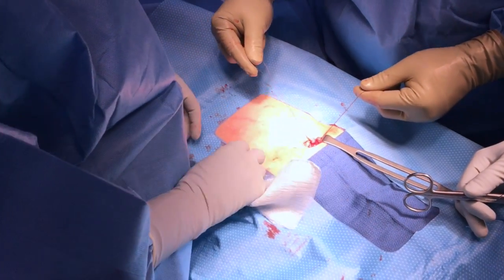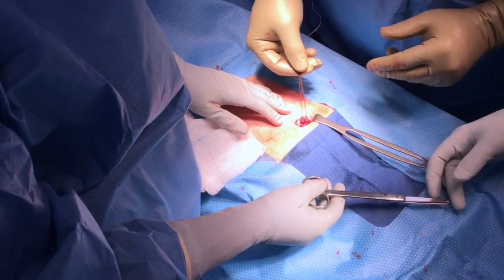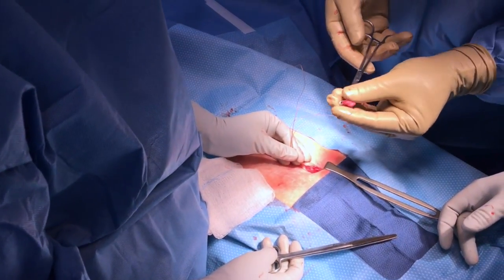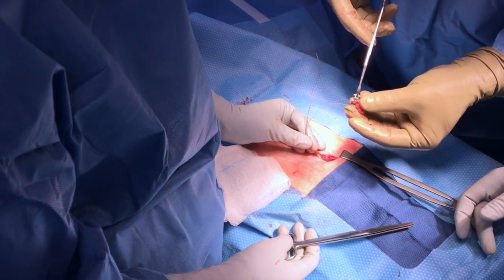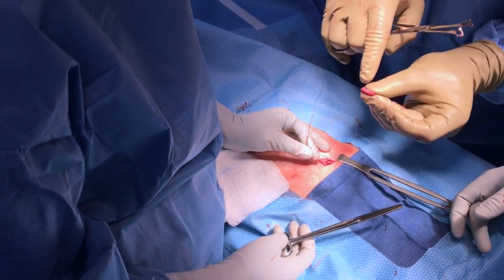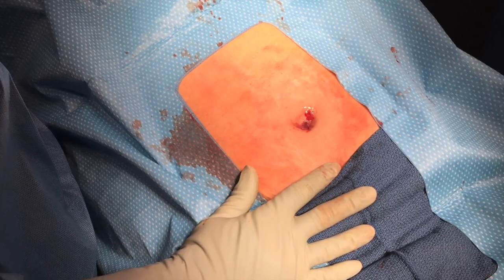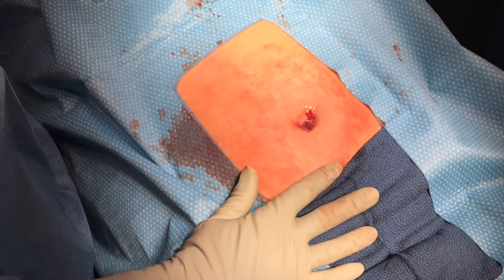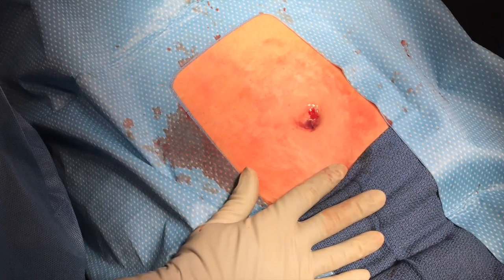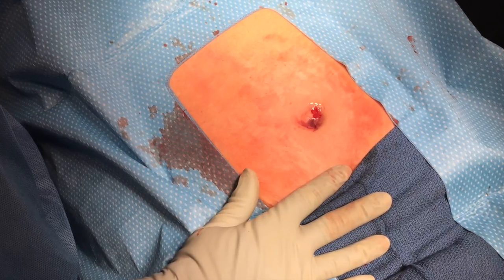It's not bleeding, so we'll cut the sutures. Also note that this actually is the tube — here I'm looking for the hot dog sign where you can see the little bit of tube sticking out. All that's left is to close the fascia, usually with just a simple figure of eight. The incision is only about 15 to 18 millimeters usually, and then the skin can be closed just with glue, particularly if you made an incision that lies within the umbilicus, which will have great cosmetic results for the future.